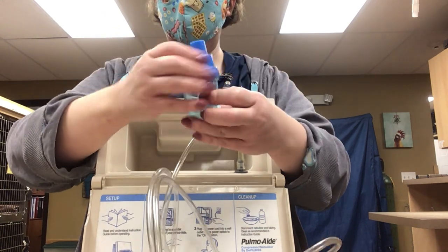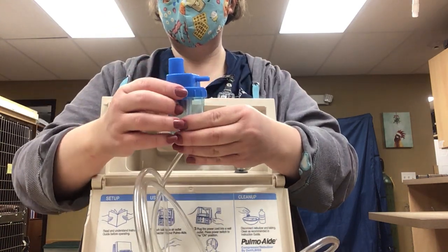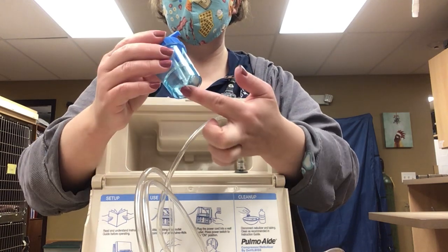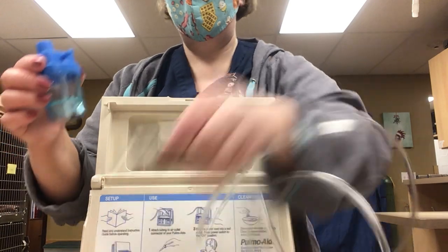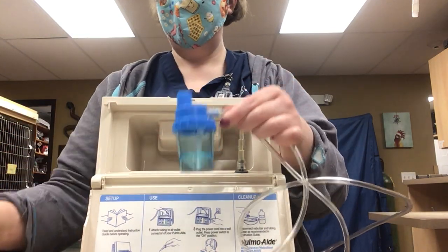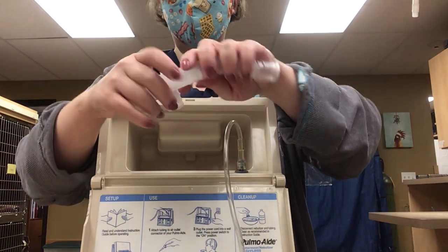You'll have a lid that screws on, and you'll see there are two different parts to this lid. There's going to be some sort of small plug — a lot of times it's here, sometimes it's on the bottom — and that's what this tubing is going to pump into. So you want to set that up. You'll also get some other tubing or pieces.